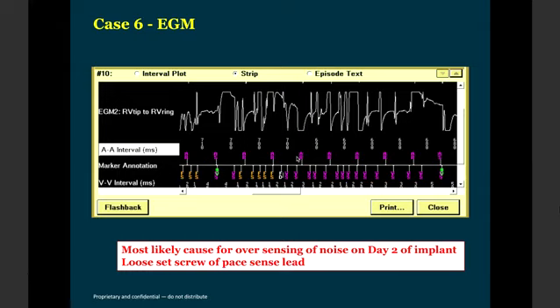Yes, sir. Because as Mukund correctly said, the can in a right-sided implant is on the right side. So if you also have the luxury of an SVC vector, there can be more myocardium coming into the vector for better shock efficacy, as he correctly said. I fully agree with what Mukund said. Any other question, Mukund?